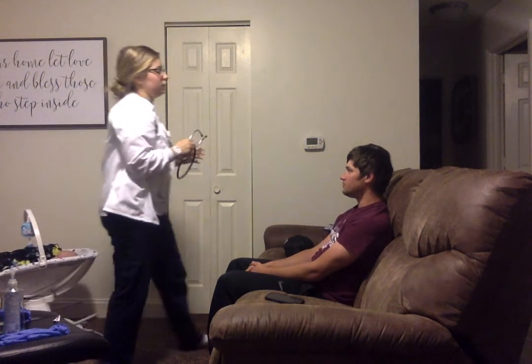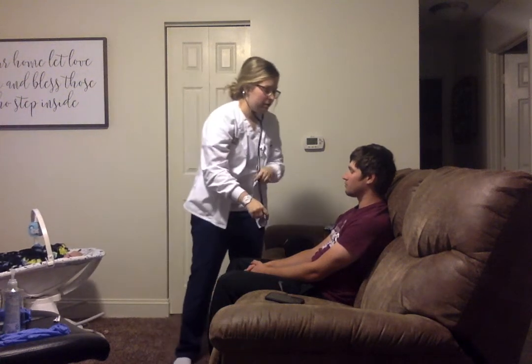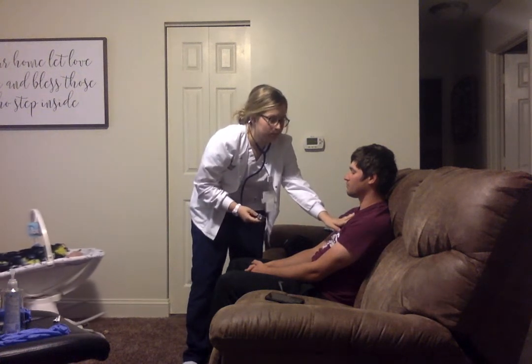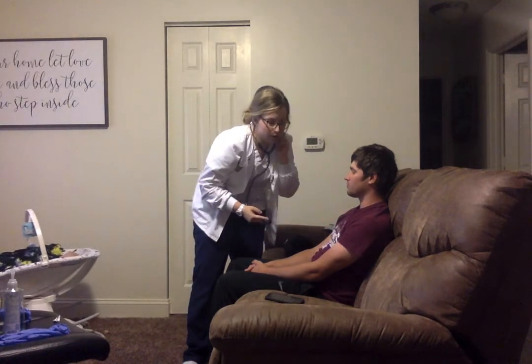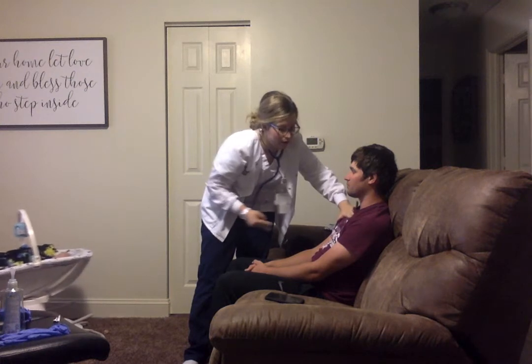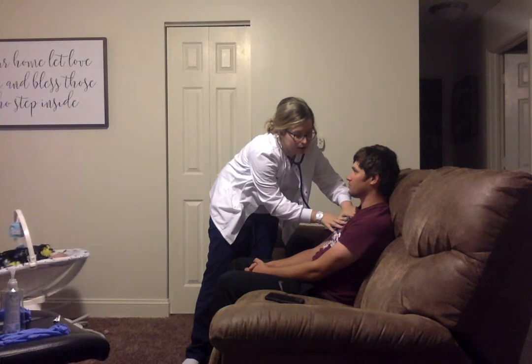All right, now that I've listened to those sounds, I'm going to listen to your heart sounds too. So let's get started on those. To find the different heart sounds, I'm going to find the middle of the sternum, and I'm going to find the middle of the clavicle and then the sternum also. To the right of the clavicle and 2 down, I'm going to listen to the aortic sound.